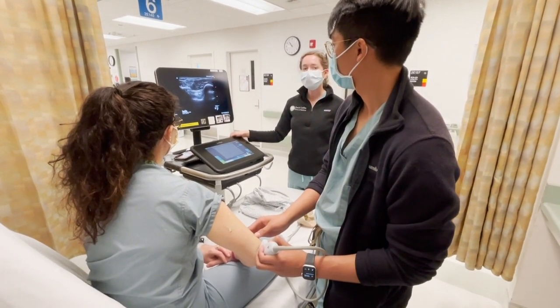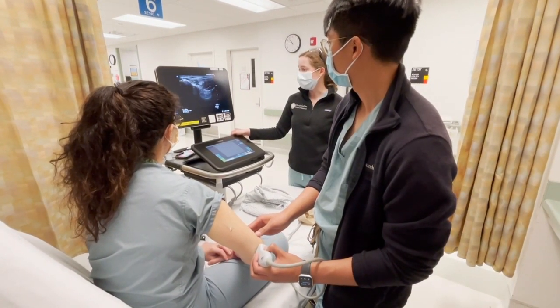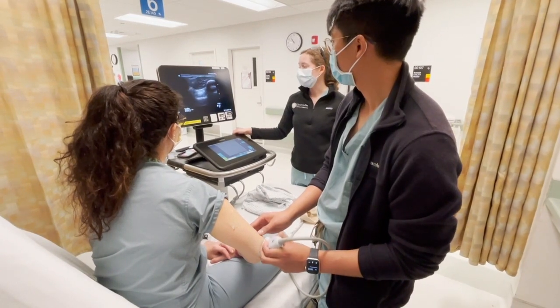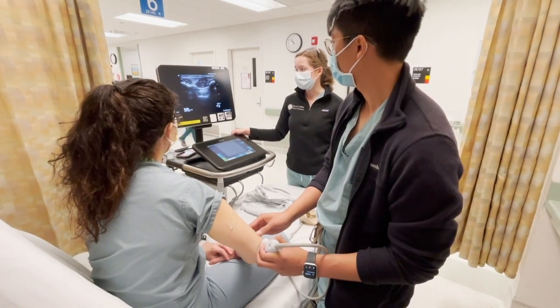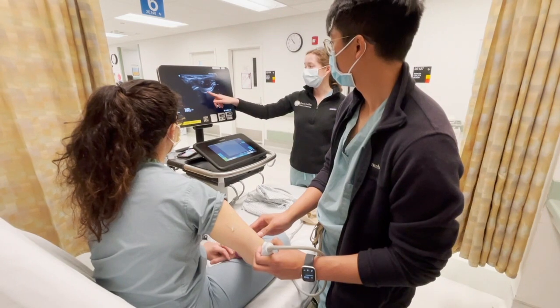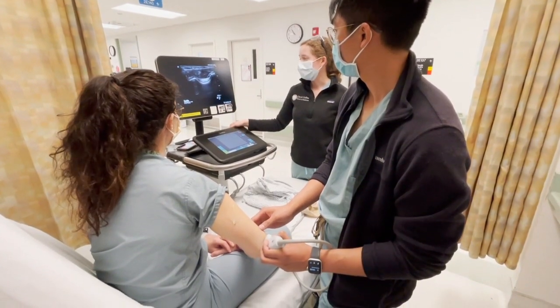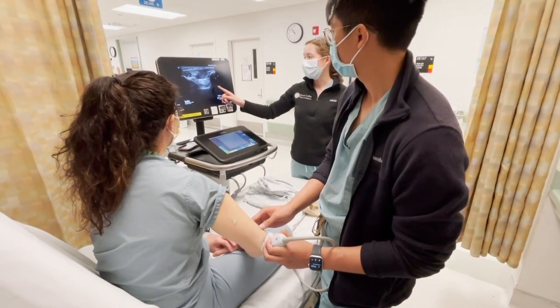Here at the elbow you can see the olecranon fossa in the middle of the screen with the epicondyles on either side. To get this image you may need to slide the probe from side to side to get the fossa right in the middle of your image, and you also may need to tilt or fan the probe to get a really nice image of the olecranon fossa, as tilting in the wrong direction may only show a little bit of it.